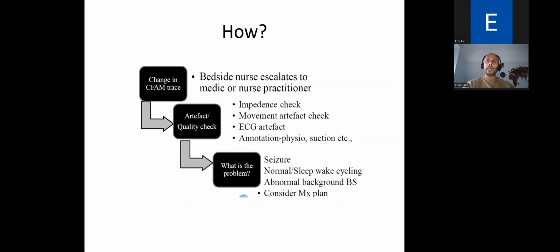Say, for example, we've got a patient who's had a cardiac arrest at home, has got return of spontaneous circulation, and has been brought into your intensive care unit. In order to maintain neuroprotection, we will continue to sedate them and muscle relax them, maintain their parameters like the CO2 within a particular range, the glucose within normal range, make sure they don't get pyrexial. And then we apply the CFAM.